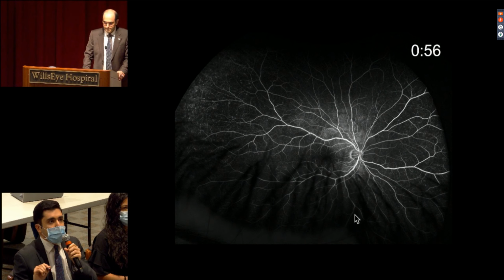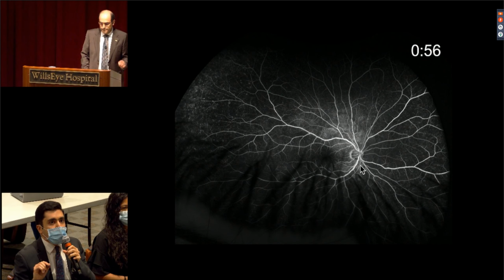And we have a wide field intravenous fluorescein angiogram. We're at 56 seconds. The veins appear to be fully filled at this point, maybe some laminar flow present here, but our attention is drawn to similar areas of pathology we were noting on the previous imaging modalities, with distinct hyperfluorescence contributing to those changes we were noting earlier.